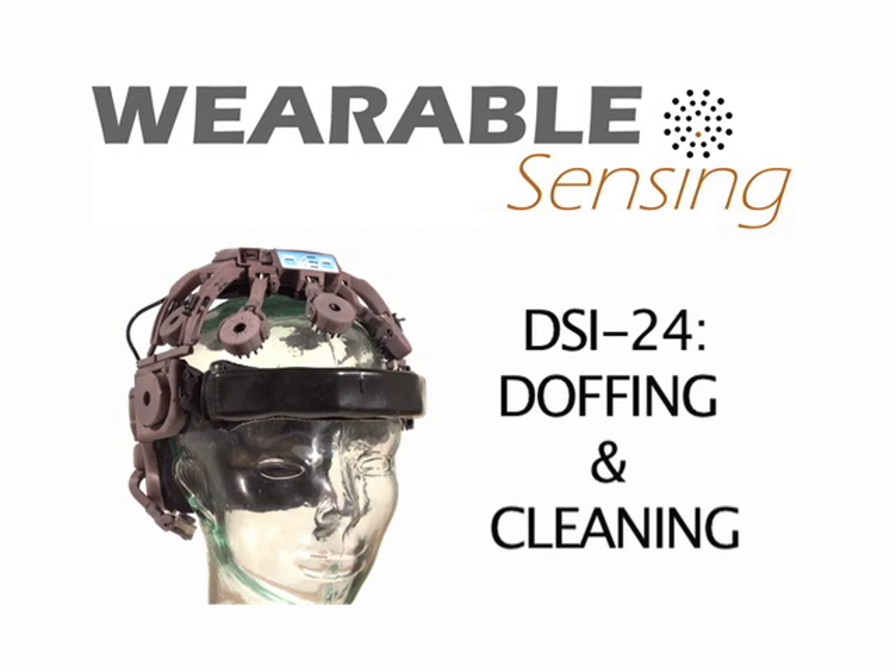This video shows the doffing, cleaning and maintenance procedures for Wearable Sensing's DSI-24 EEG headset.